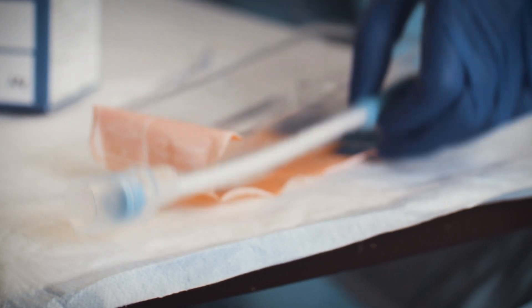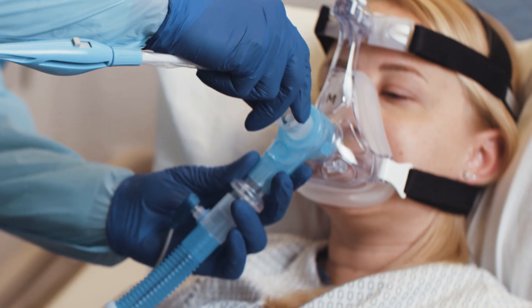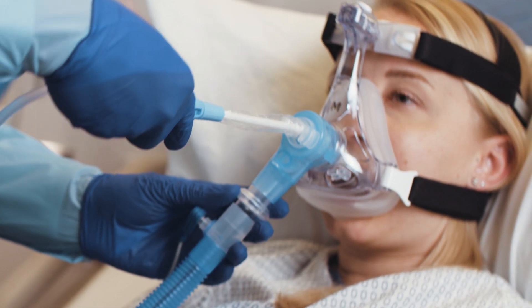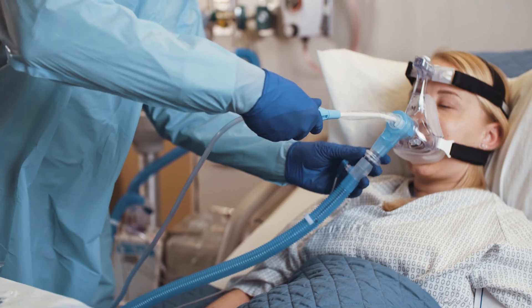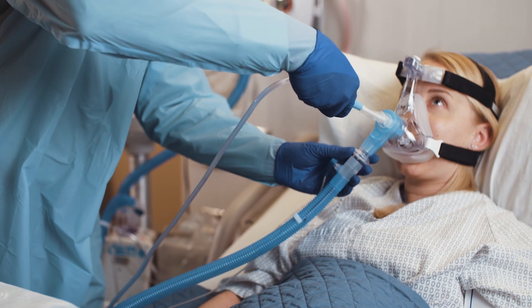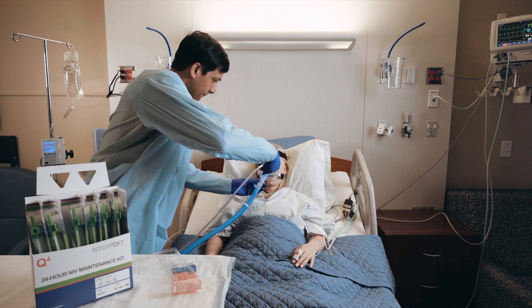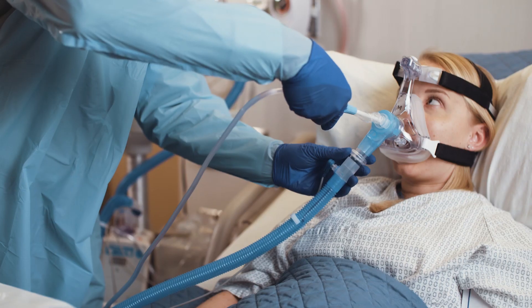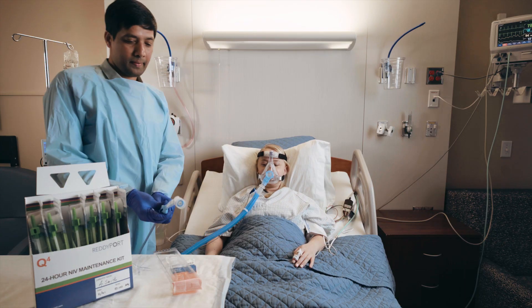To use the Yankauer with the ReddyPort elbow, stabilize the mask with one hand and push the protective guard into the ReddyPort elbow with your thumb and forefinger. Gently slide the Yankauer into the elbow through the mask and into the patient's mouth using gentle pressure. Apply suction by toggling the on-off slider on the handle. Remove the Yankauer by gently pulling the handle until the suction tip is fully recessed into the protective guard, then continue to pull on the handle to slide the guard out of the elbow.